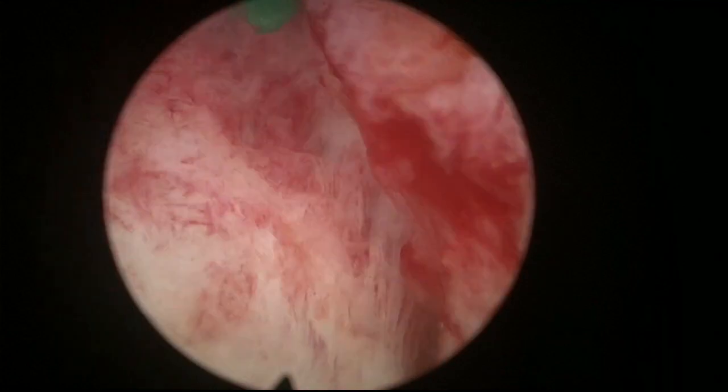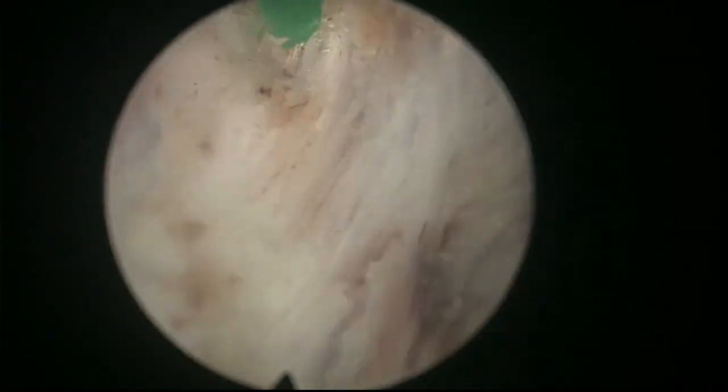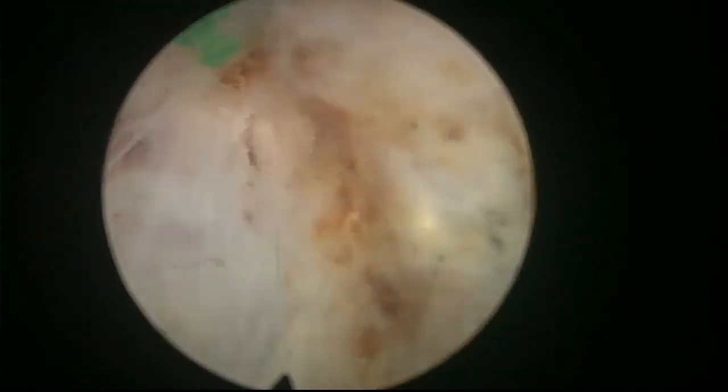You see that the quality of the view has fallen a little bit. Maybe due to the fact that we no longer have this small chamber that we are irrigating. So there's water going in the bladder and some blood as well. It will be a little bit difficult.